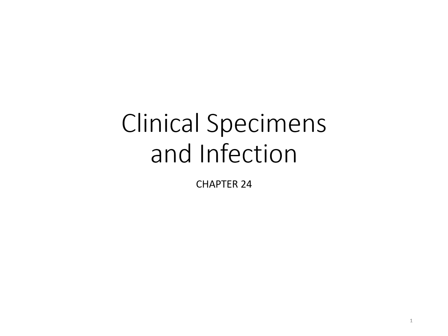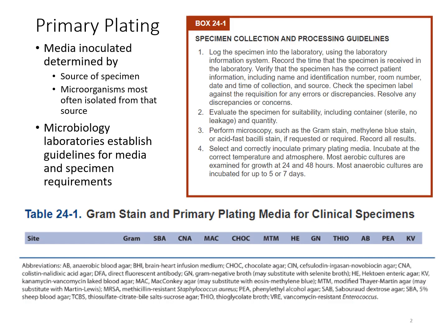In this lecture, we will cover the clinical specimens and infections as they relate to the clinical microbiology lab. Now, first we need to understand that each microbiology lab may operate just slightly differently. And so each laboratory will establish their own guidelines as far as the type of media that they will use and how they will handle the various specimens that are sent to the lab, but for the most part they're going to follow a general outline.